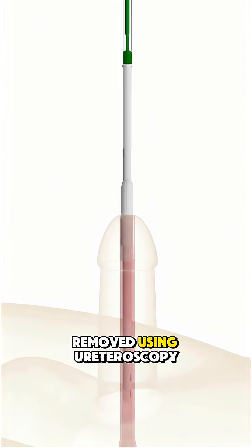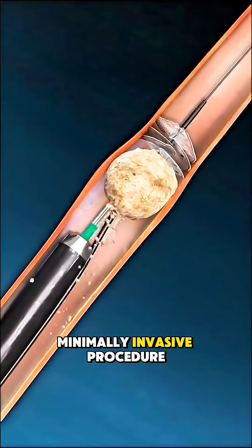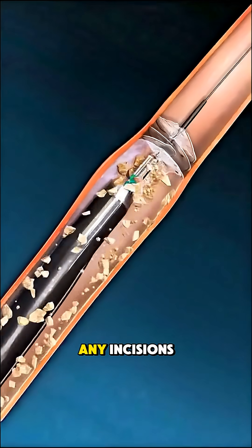Ever wondered how kidney stones are removed using ureteroscopy? Ureteroscopy is a minimally invasive procedure used to remove stones from the ureter or kidney without any incisions.